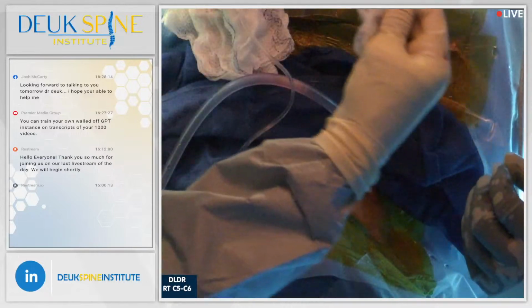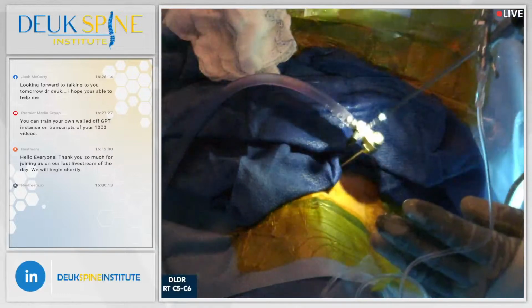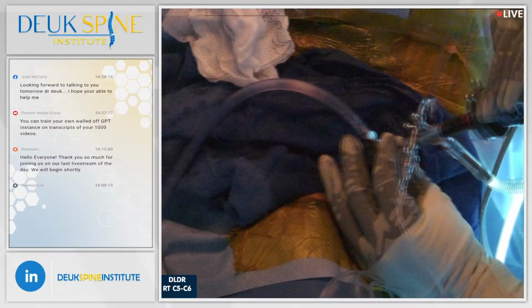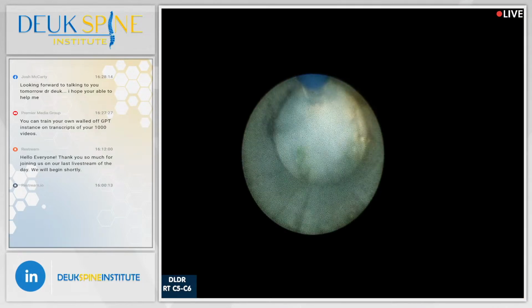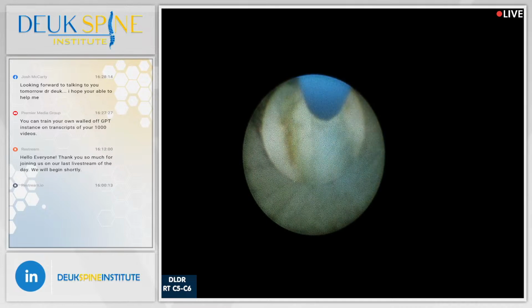No, a little bit. All right, so the surgery is basically going back and forth between using the laser and using the grabber to take out pieces of herniation. Here's another big piece of herniation right here. You can see how it's stuck from inflammation, scarred down to the edges at the back of the disc.